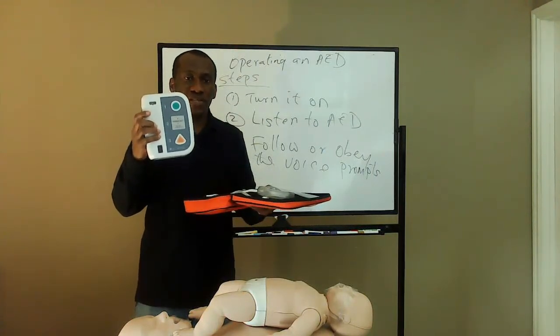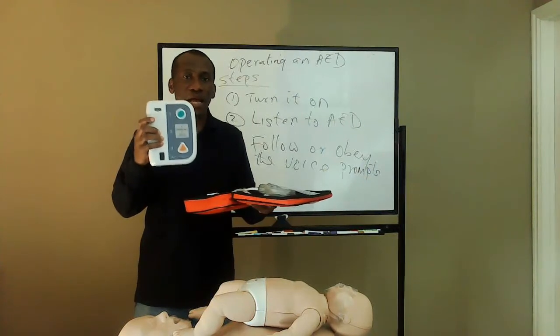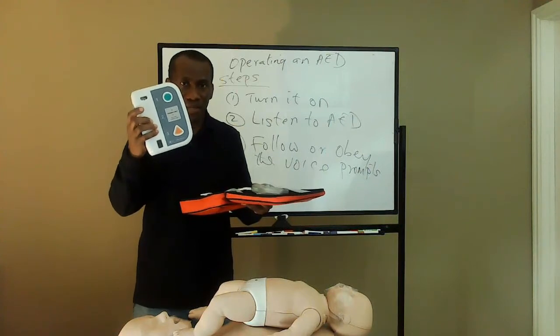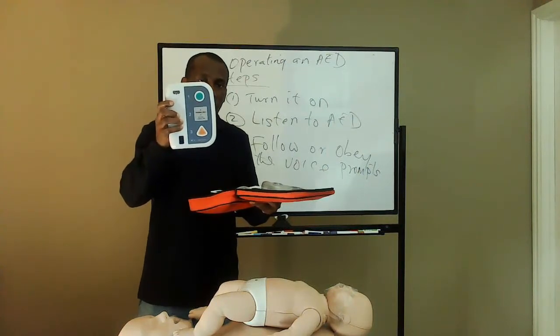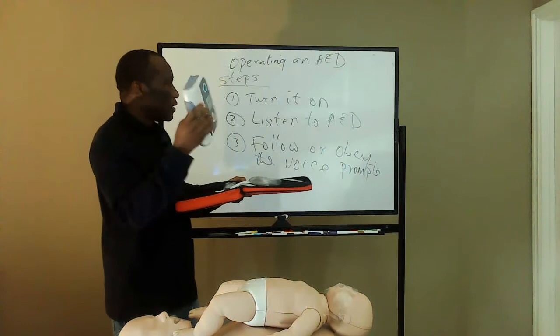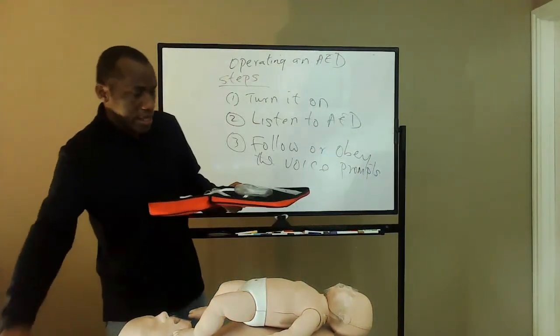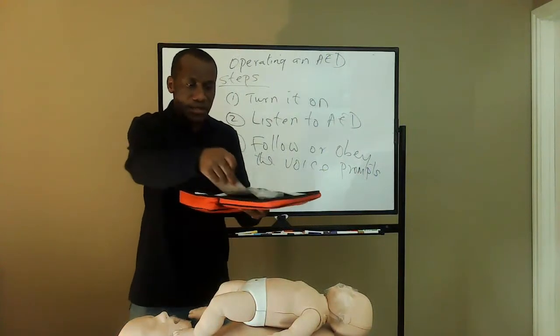Just as I said, AEDs can come in different sizes, shapes, colors, and designs. So that is the device itself. Now there is the pad.